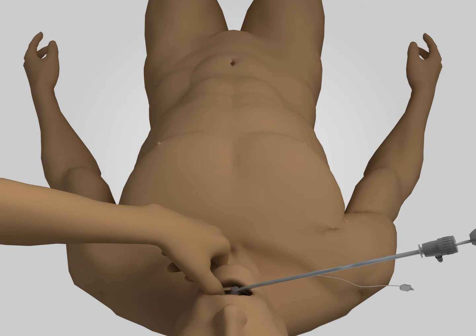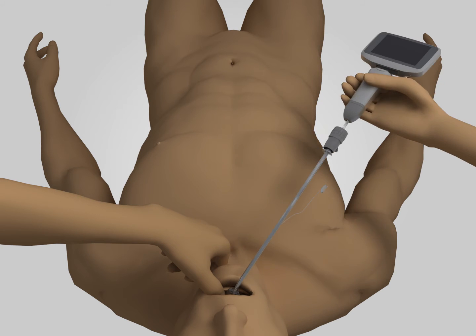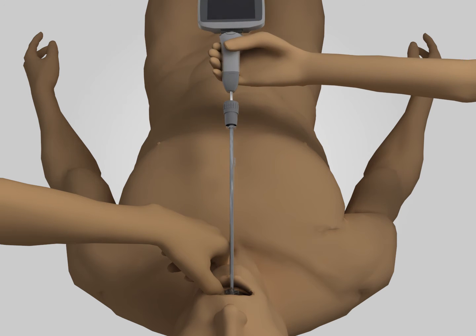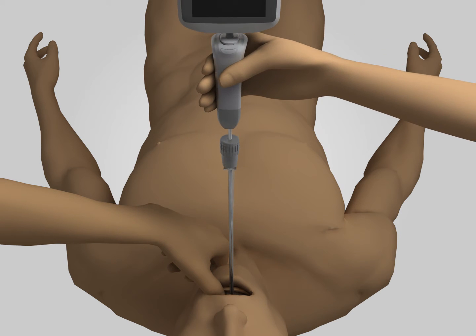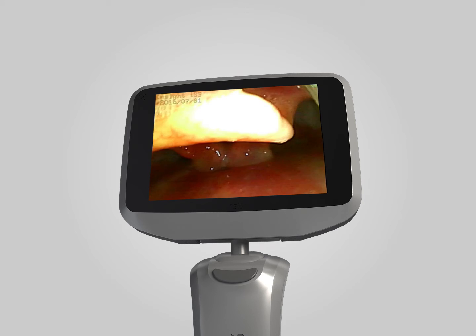If patient situation allows, use the thumb and index finger of the left hand to lift the patient's lower jaw, then insert the tube into the patient's oral cavity from the right corner of the mouth. The direction of insertion shall be perpendicular to the long axis of the patient's body. Rotate the video rigid laryngoscope parallel and counterclockwise, and erect it along the direction of the operator while observing the monitor screen.